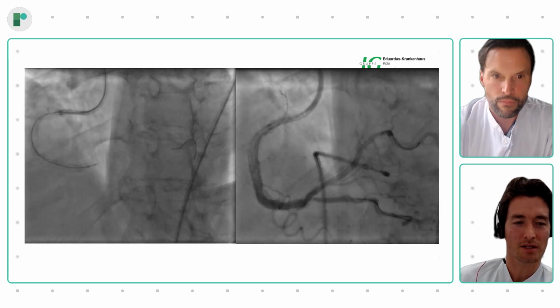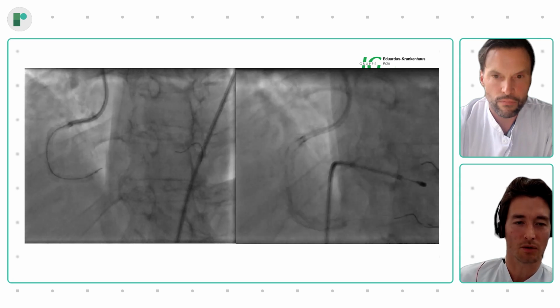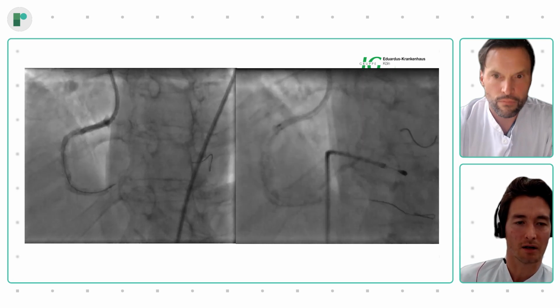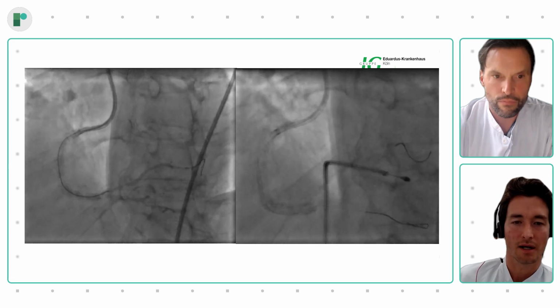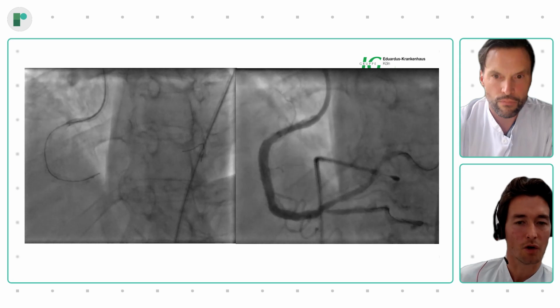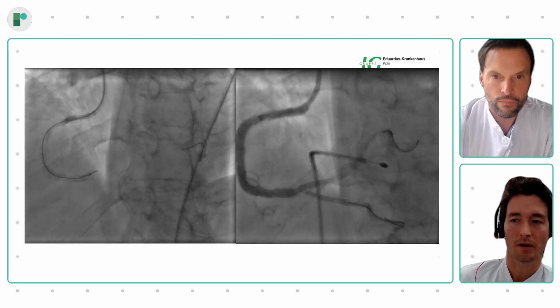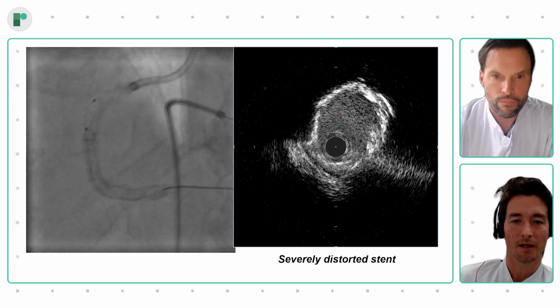This is a very smooth and almost calming procedure with orbital atherectomy compared to rotational atherectomy. You have to be patient in the use of orbital atherectomy when you're only used to rotational atherectomy, but it really has a great impact on plaque modification in calcified scenarios. And on the right-hand side, after the use of orbital atherectomy and already pre-dilating with NC balloons, we have achieved a fairly good result.